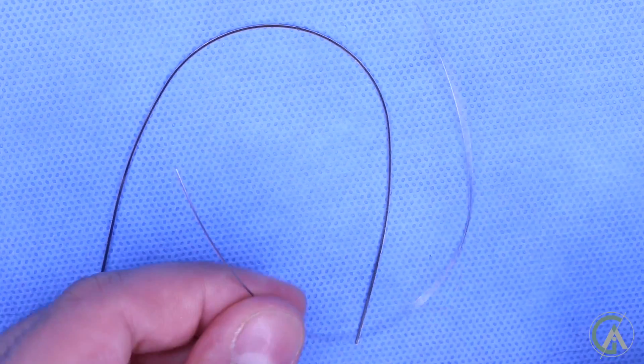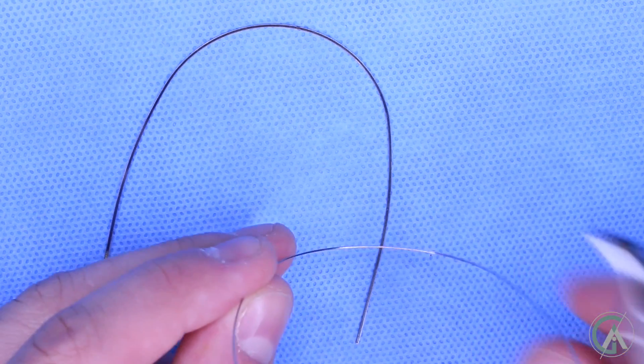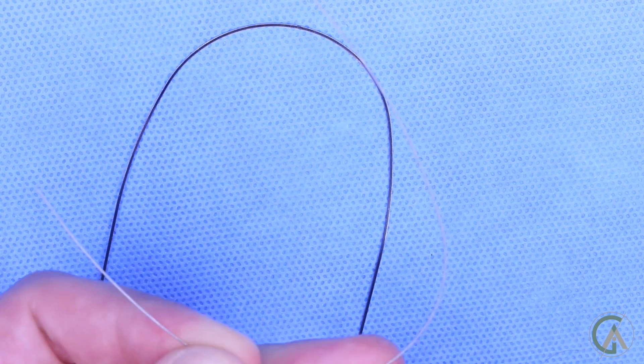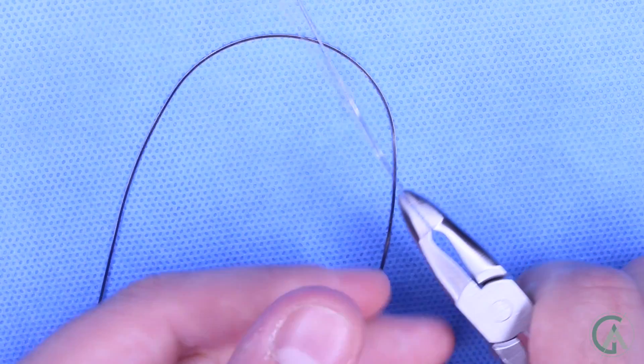Nickel titanium is a really, really cool type of metal. It was discovered for space studies, but it actually has shape memory so even when you bend it, it springs back out to its original shape. So here we have a round nickel titanium wire and when you look at the cross section of it — when you look straight down the wire — what you'll see is that it's round in its shape. And when you try to bend this wire, it springs back to its original form.